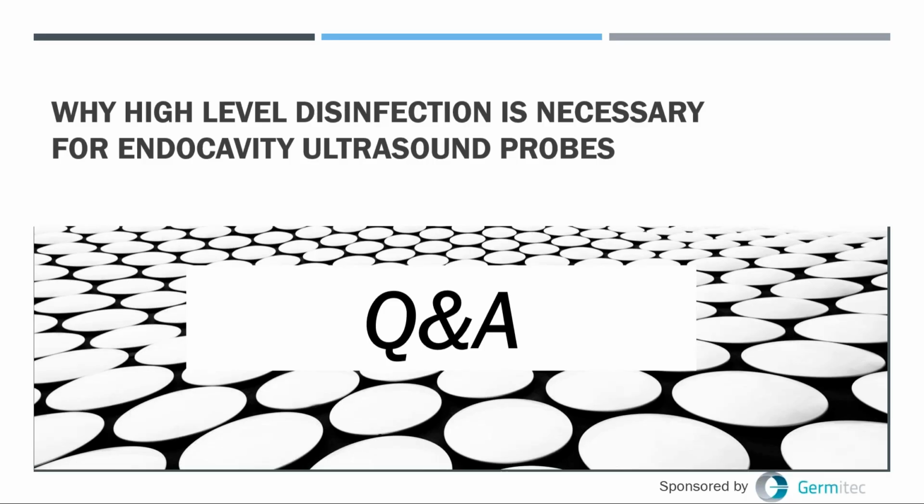And I should say, when one looks at using some of those HPV culture techniques, there is a literature that suggests that some standard high-level disinfecting chemical agents may be unable to inactivate HPV. So that is an ongoing area of research and concern.